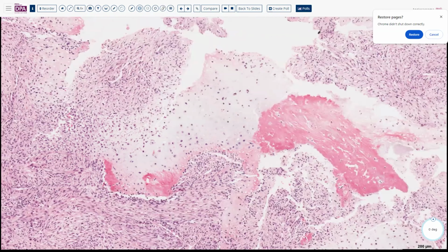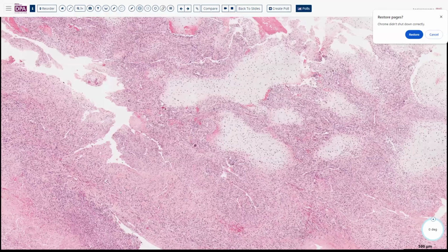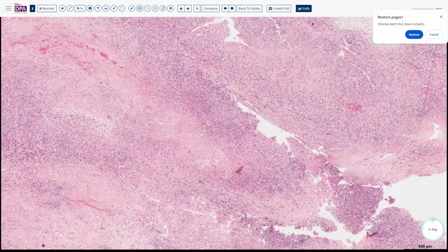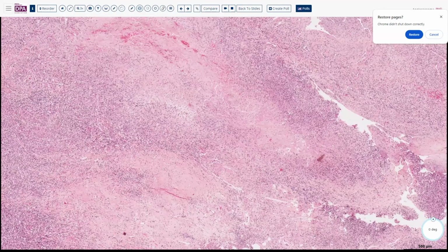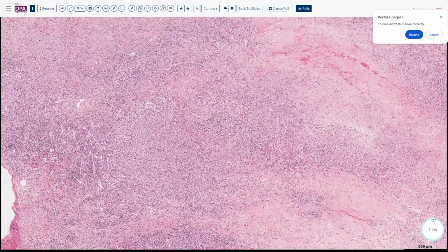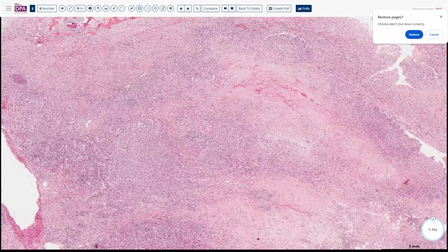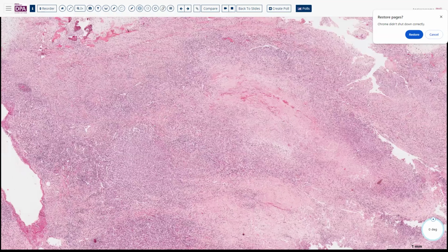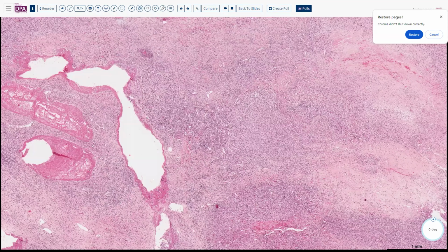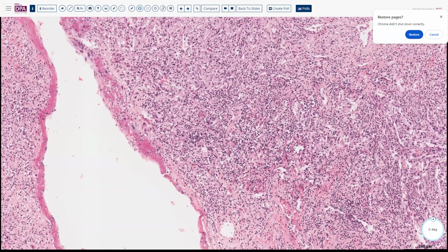and it doesn't have the high cellularity tissue. Now, in more recent times, we have been able to define certain neoplasms in the heart of the sarcomatous type as intimal sarcomas. Those are tumors where you get an abnormal reduplication and proliferation of the endocardial intimal cells. And we might have some of that going on here.